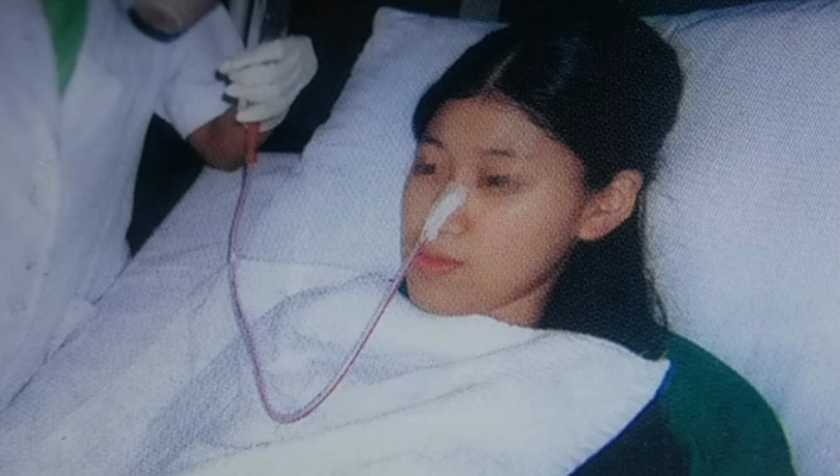Check whether bowel movement is present or not. Why do we have to see whether peristalsis movement is present or not? Then we have to observe the digestion process. For that, we have to check the bowel movement.